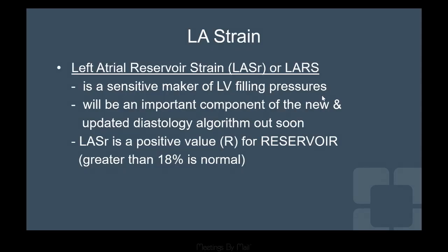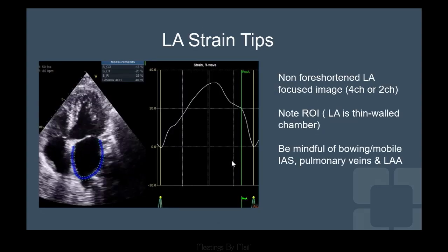LA strain, Amy just went over, and it's a very big highlight for us here at the conference about how it's going to be more incorporated and used in our new diastology algorithm. And keep in mind that 18%, that's our number that we want to focus on if it's greater or less than 18.